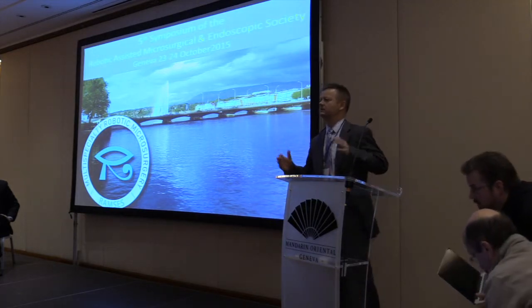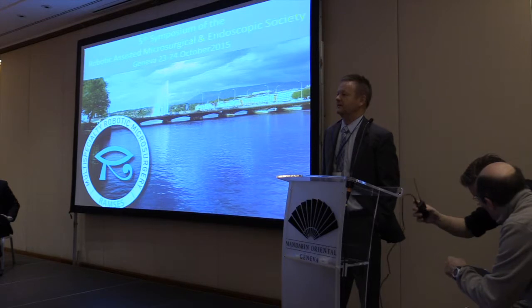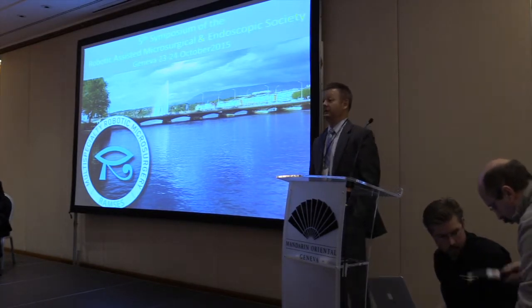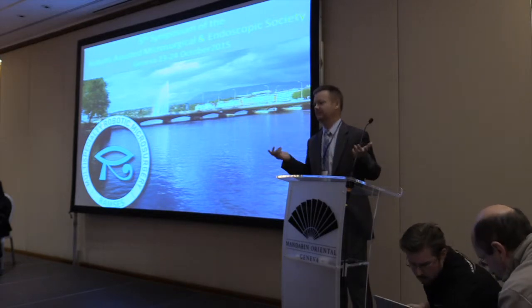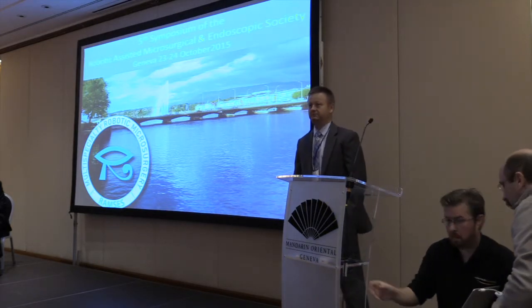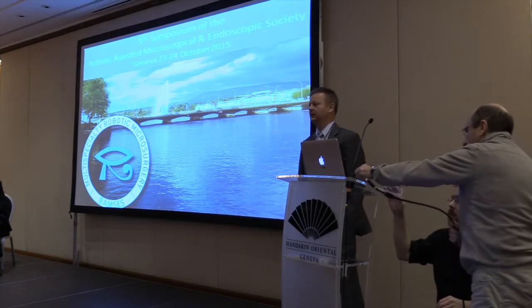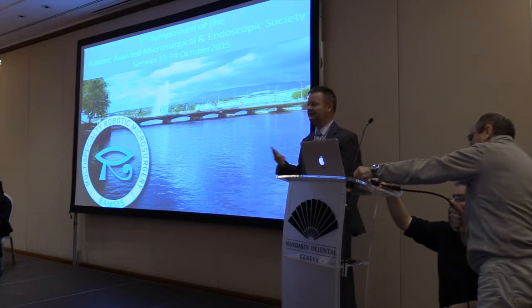And the second one was, how does that short laparoscopic experience compare in terms of some of the statistics that you showed, in anastomotic time, clamp time, mortality, for instance? If I remember my first total laparoscopic left iliofemoral bypass, it was very simple. 8 hours. Clamping time around 2.5 hours, and the patient stayed in the hospital 3 weeks with compartment syndrome. My colleague told me, it's not a good way. It's not minimally invasive, 3 weeks in the hospital.